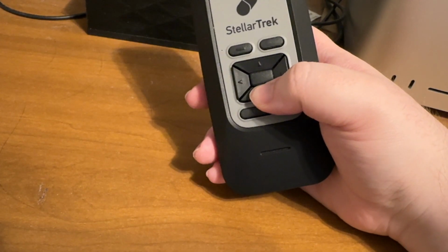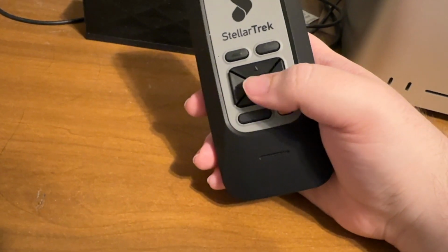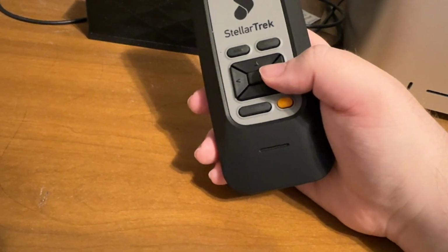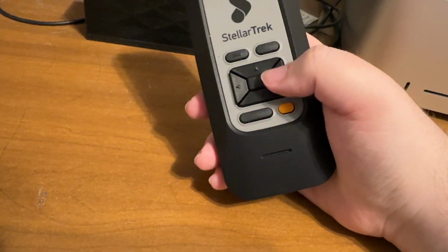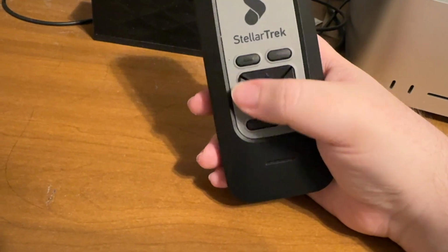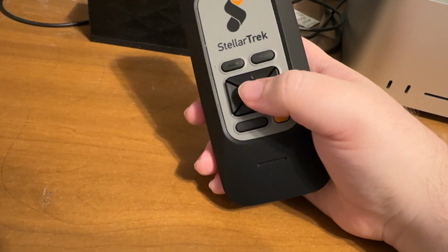Proximity. Last used. City. Press confirm to sort by city. Let's see if that does it. Sorted by city. Select a city. Boston. Quincy. Okay, so now we can actually select. Boston, Cambridge, Braintree, Town. What city do we want to look at? Cambridge, Boston. So let's say Boston.